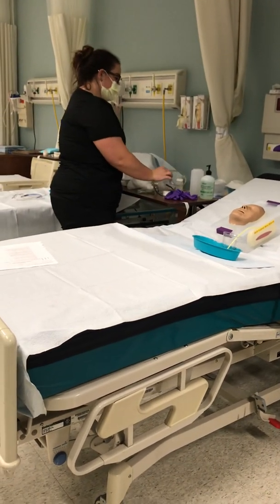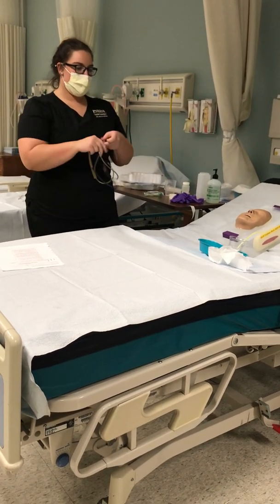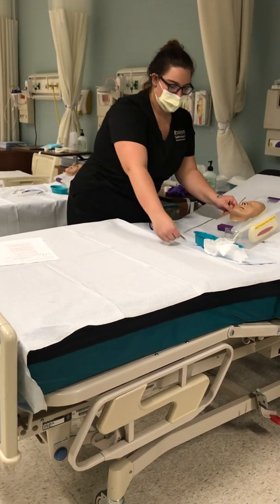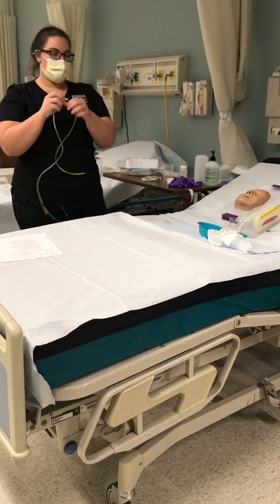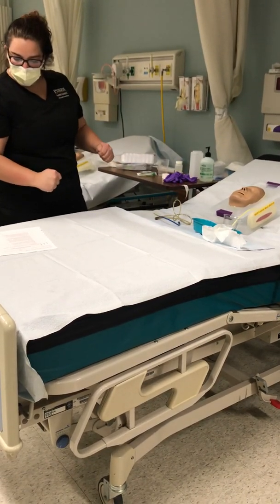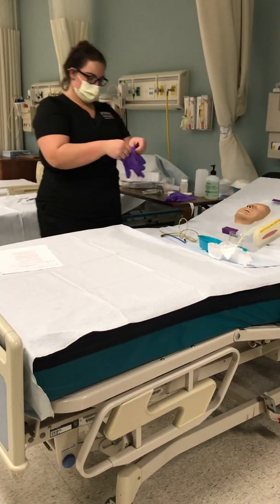Then I would measure. I'll also give them some tissues in case there's some teary eyes while this procedure is going on. Then I would measure the tube from the nostril to the ear, and then down to the xiphoid process, which is already marked, so I'm not going to mark it again, but there's a piece of tape on it to mark it. And then, once I'm done with that, I will go ahead and put on my gloves.